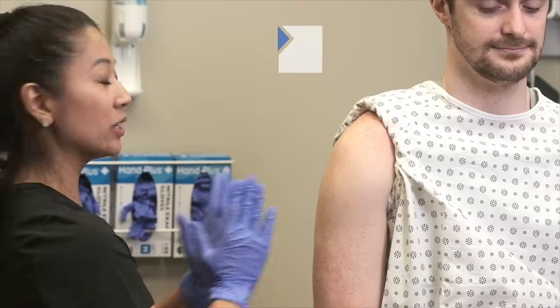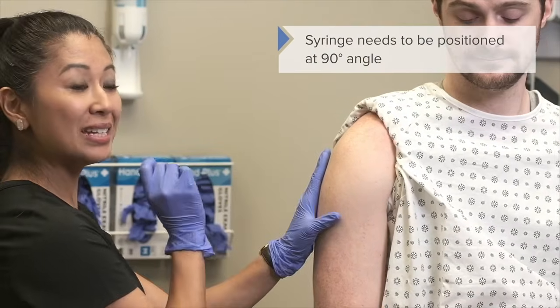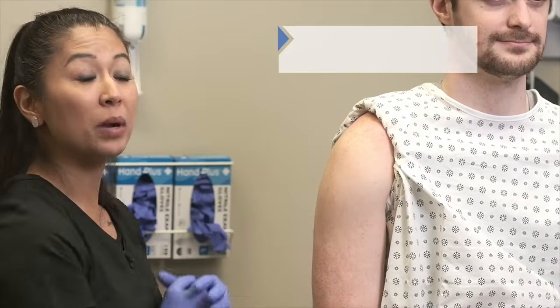Now let's take a live look at IM injection. With my patient, positioning is really important. Notice, luckily I'm not very tall, I've got my patient positioned to where I'm at a full 90-degree angle. When I go to give a 90-degree injection, I am head on and straight with my patient's arm.